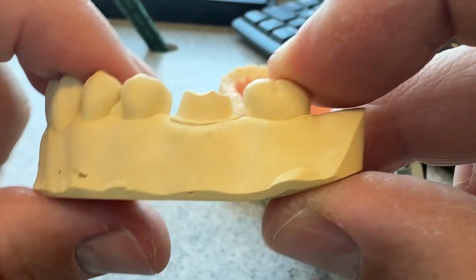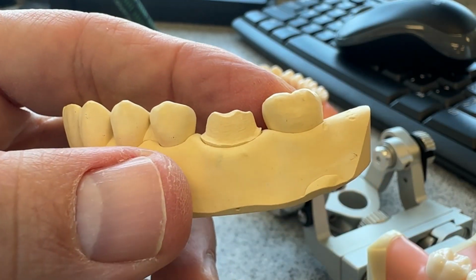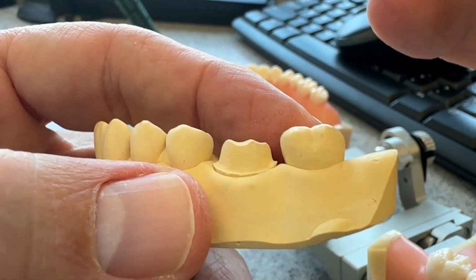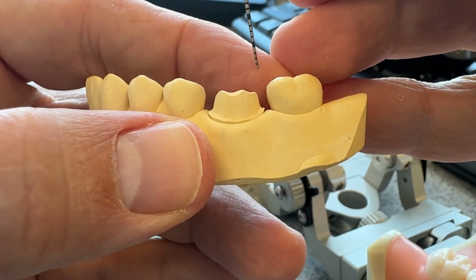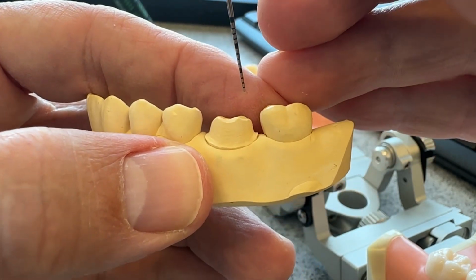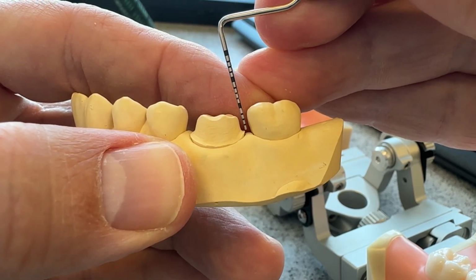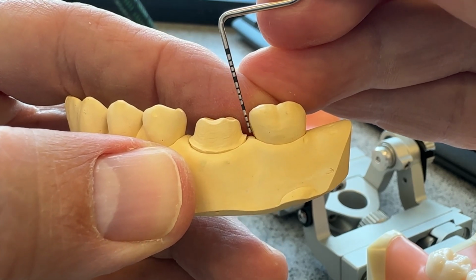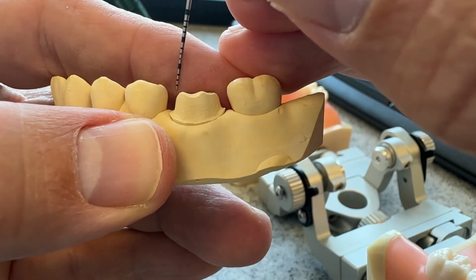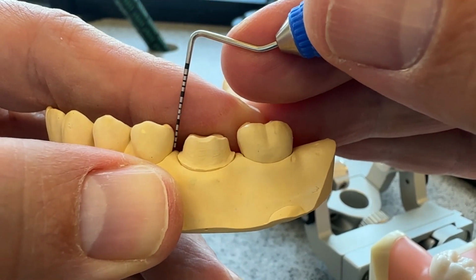Okay, here's a few key things to look for as you are analyzing your crown prep. This doesn't cover everything, but it's a few things that I point out to all the students when I come back. First, a few big picture things. Your orientations. Are you breaking contact on the mesial and distal at the same angle as that proximal surface? You want to be coming through at that same angle.